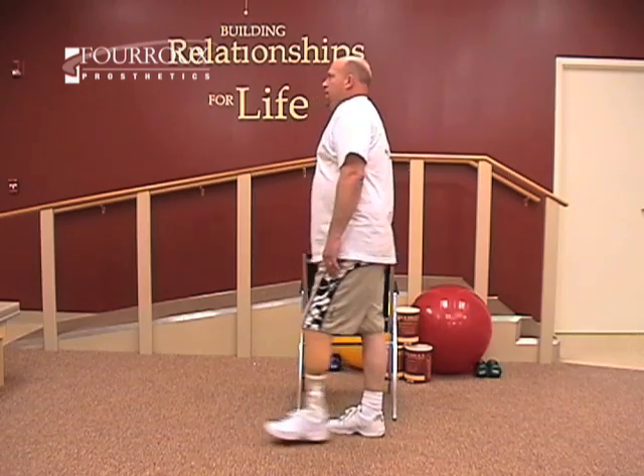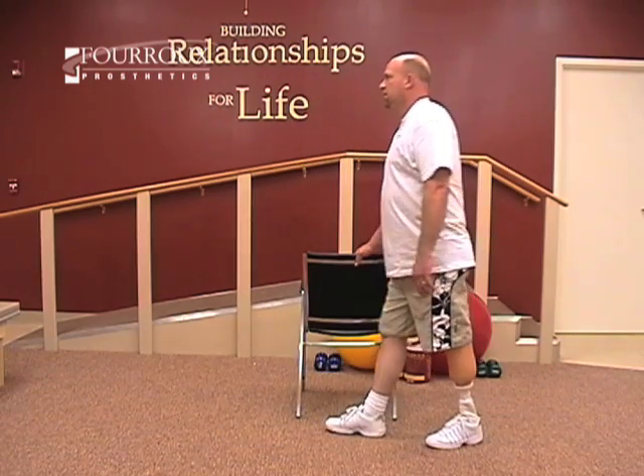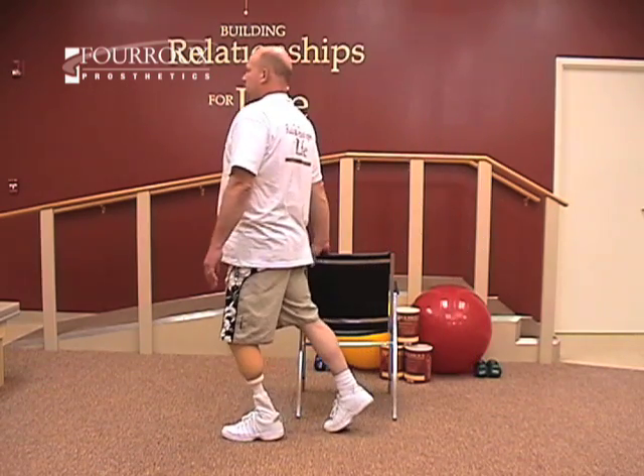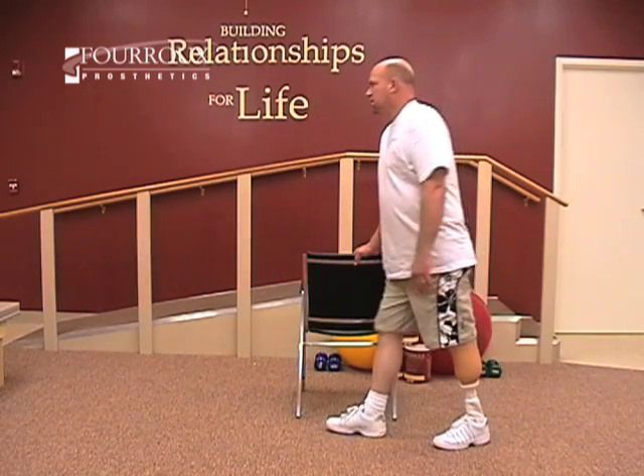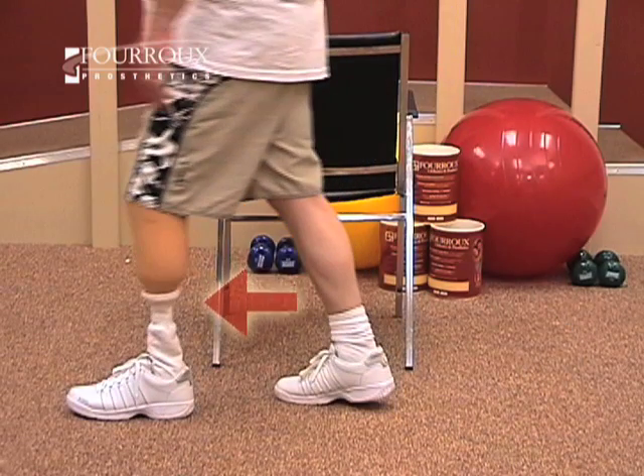This is called prosthetic limb stepping, and it will help you learn to walk properly. You may want to use a railing or chair for stability. You'll step with your prosthesis, and your other leg will stay in place.